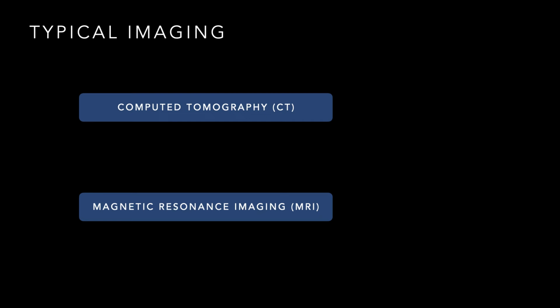But before we get to ultrasound imaging, we want to talk about the typical or the conventional imaging for Morel-Lavallée lesions, at least in 2024, right? And so that falls under two major headings: CT imaging and magnetic resonance imaging, or MRI. Probably not going to be picking these things up too well on plain film X-rays. So it's going to be one of these cross-sectional forms of imaging, right? And when I say CT, it's certainly a possibility, and it's probably going to be one of the frontline tests that we do, at least from the emergency department, to make the diagnosis if we're not ultrasounding them, just because CT is ubiquitously available, it's rapid to get in and out of, and it also can tell me not only the extent of the injury, but also what other injuries are there in the process.